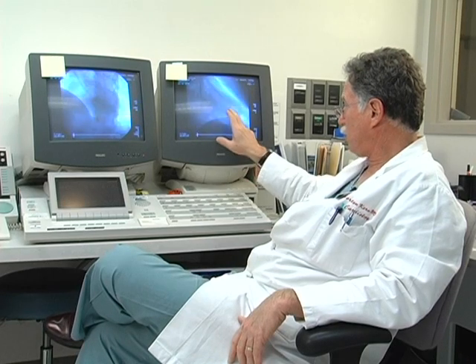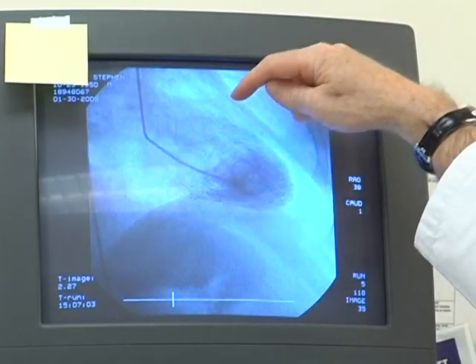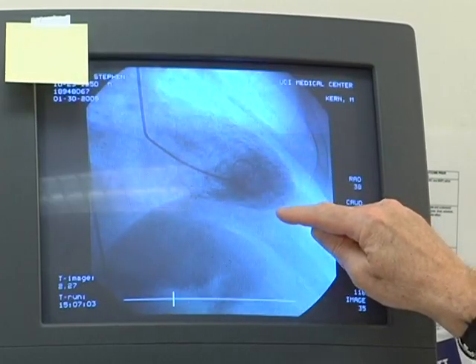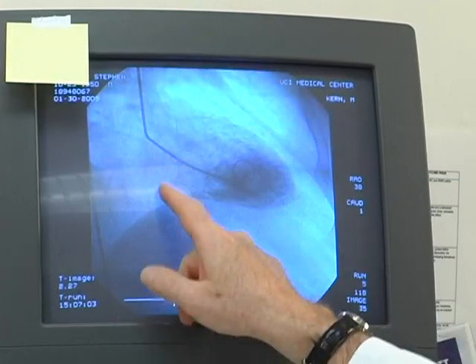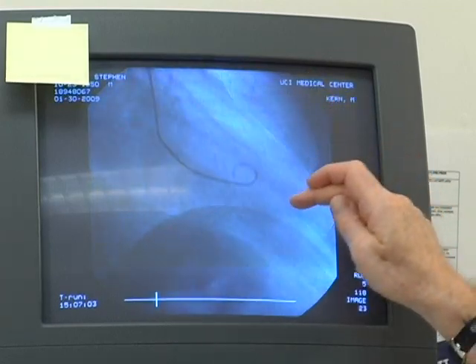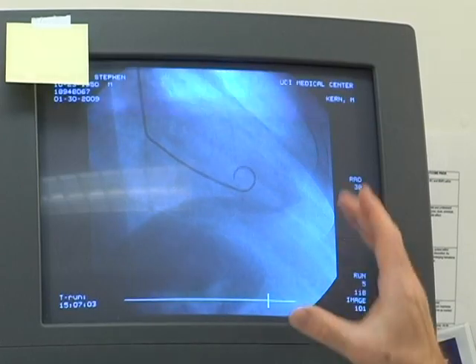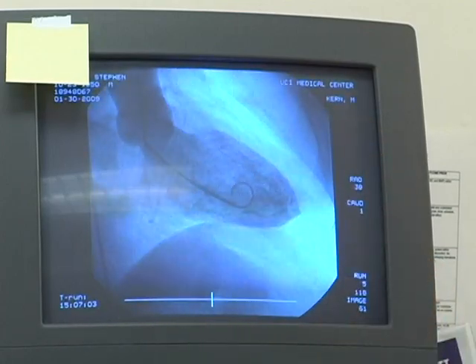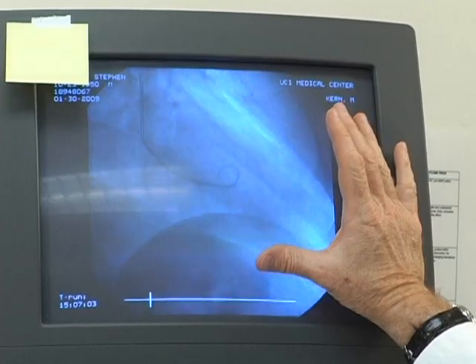The walls of the ventriculogram are all moving, and let's look at the 5 walls of the ventriculogram in this right anterior oblique projection. So in diastole, with the heart fully expanded, we have the anterior basal, anterior, anterior apical, inferior basal. The plane of the mitral valve is here, the plane of the aortic valve is here. And you can nicely see that every segment of the walls of this man's heart are squeezing and contracting to the center normally. The difference between area of diastole and area of systole is the ejection fraction, and above a 50% change in that area is normal.